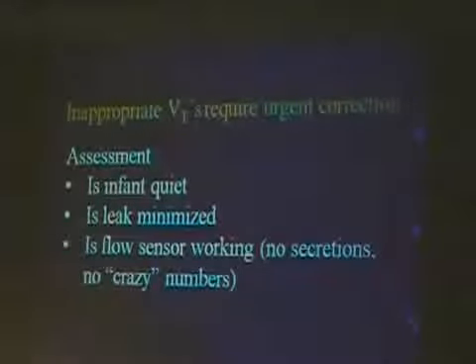Now, inappropriate tidal volumes, therefore, require urgent correction. This is because of the data from the animal studies showing that even a few breaths with inappropriate tidal volumes or a period of even a couple of minutes with inappropriate tidal volumes can cause a BPD-like picture. It is not something that we can say, oh, gee, call the therapist and after he comes back from lunch he can reduce the pressure on the ventilator. Inappropriate tidal volumes require urgent correction.